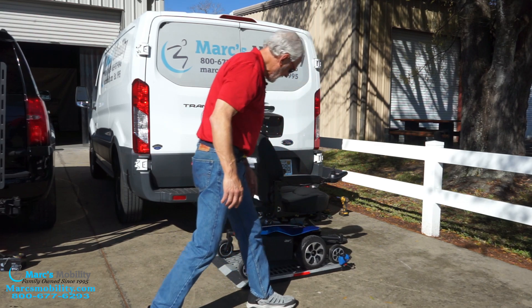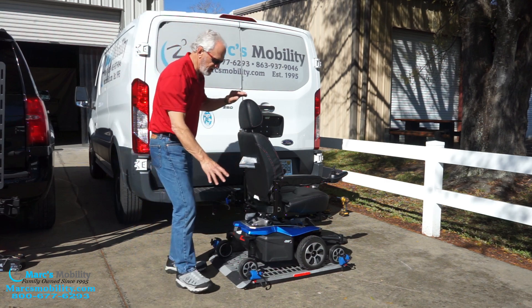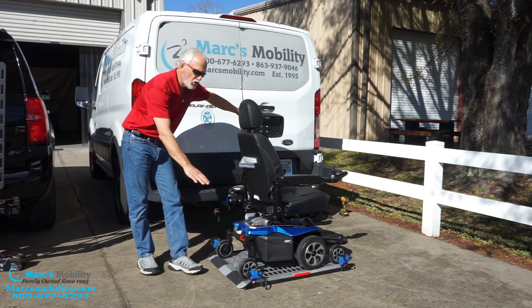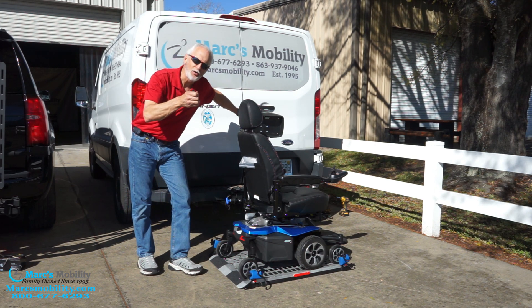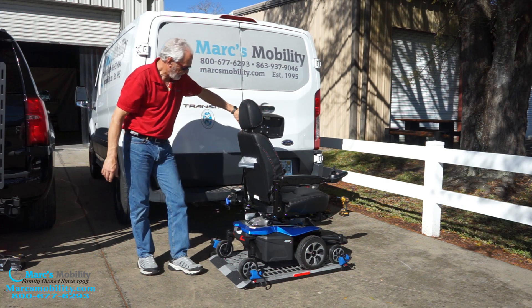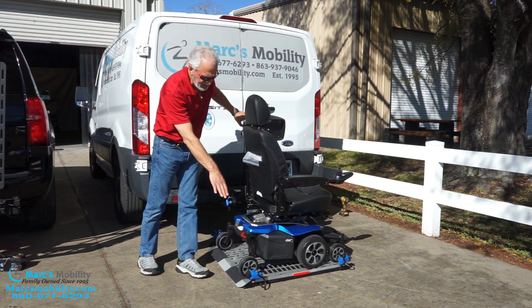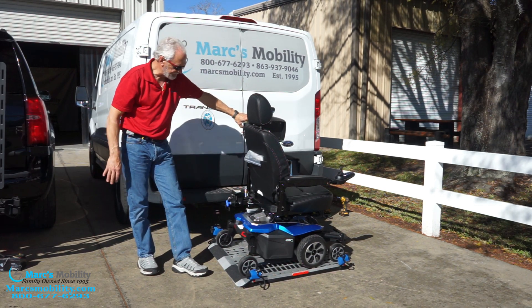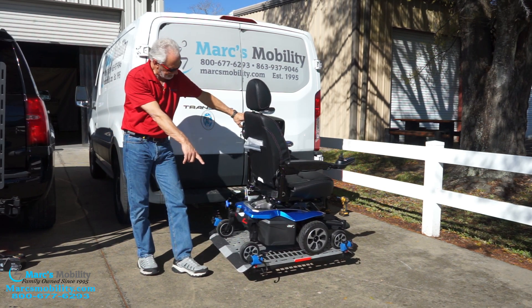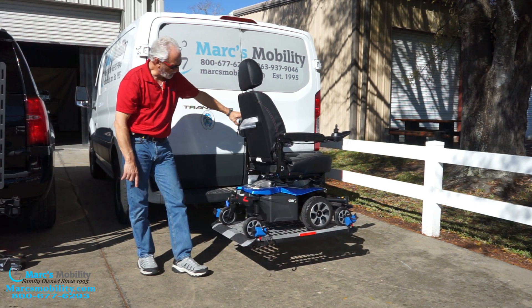You bring the chair onto the platform like this — the platform is universal, it'll fit all power chairs. Now you can tie the chair right away; I like to wait until it's up, but don't forget to do it. When you go up with the lift, you should run your car — it gives more power to your lift and makes it quicker. So we're going up. It is going to tip down for a second, then come back up. You'll see the tilt — and now it's going to keep going all the way up.